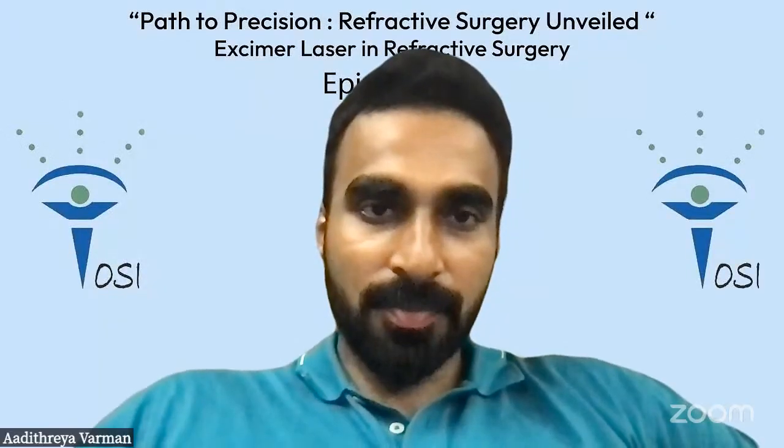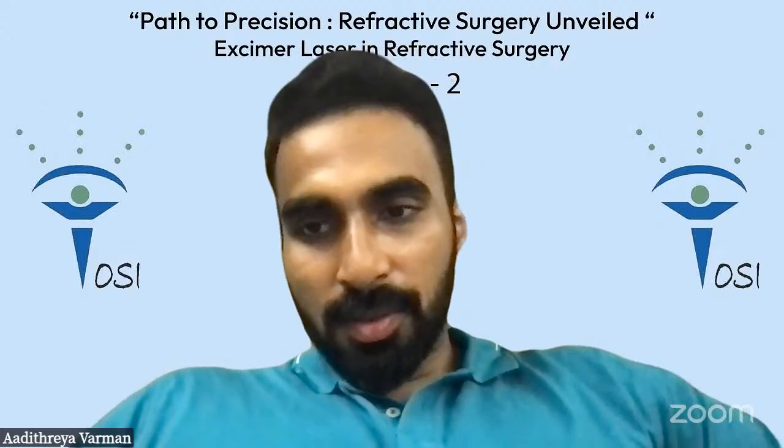Correct. So it is true, but of course, adaptive optics is a little cumbersome. Not everybody can do it. It's like the great grandfather of biomechanics. It's very difficult to incorporate in the practice. So we've a lot of times not done patients because we know that the spherical aberration induction is going to be more than 0.5. We don't touch those patients. We give an option of EDOF because they work very well, or we don't do anything at all.